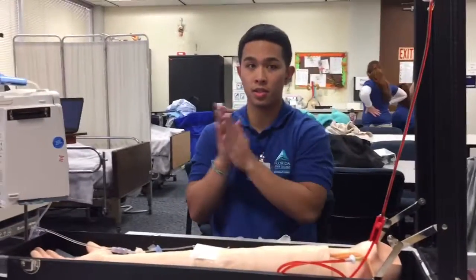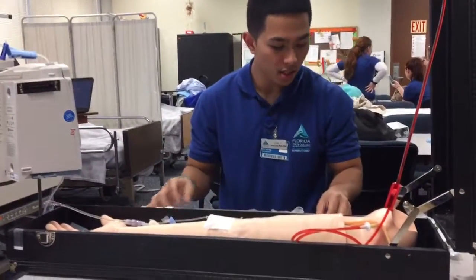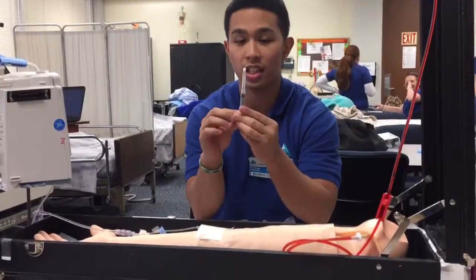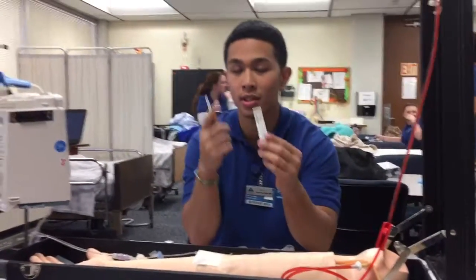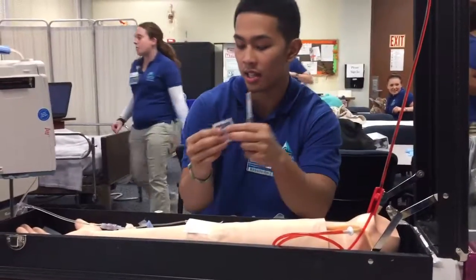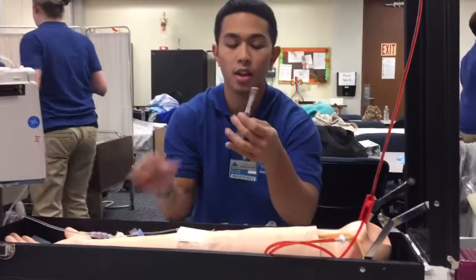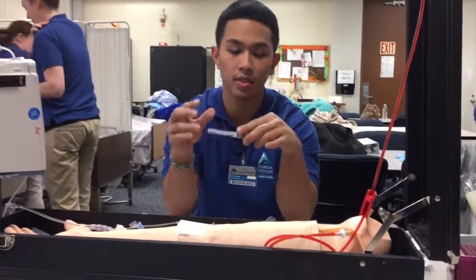So what we're going to do is wash our hands. Hand hygiene. This is the Flagyl right here. This is a needle that should technically be sterile. We have one here in the wrapper, but this one doesn't have one, so we're going to assume this is still sterile. We're going to cleanse the top of the Flagyl vial with an alcohol swab and dispose of this. We're going to pull up 1 milliliter of air into this syringe right here. Uncap this, throw that away.